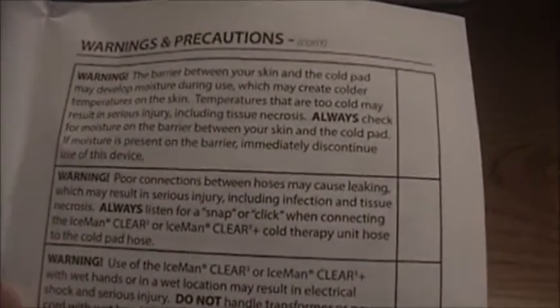Poor connections between hose could cause leaking. We found that out the hard way. The first night we had this, we were all really tired. I actually hooked this up, and I'll show you guys later, but there are little clamps that connect the hose to the pad, and I didn't have one totally plugged in. The next morning we had a pool of water on the carpet, so yeah, I could definitely see why they're putting that in the book.